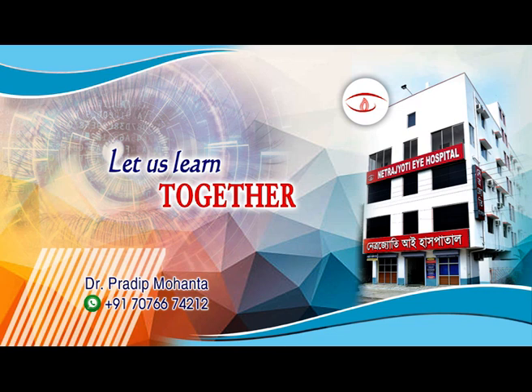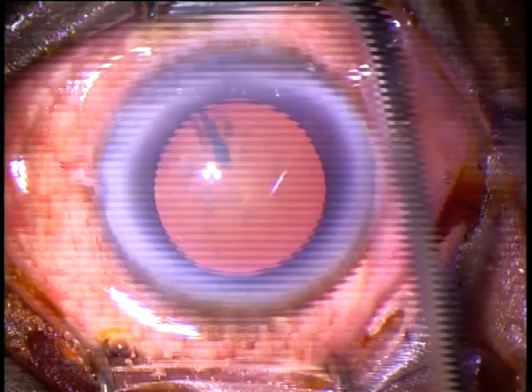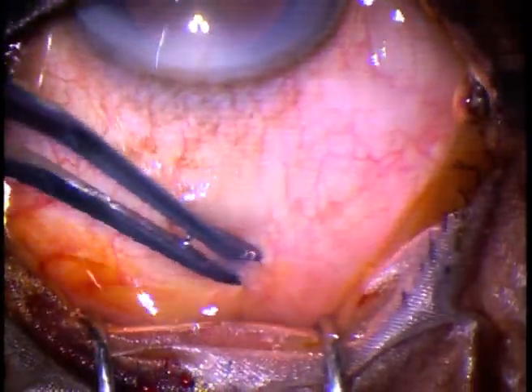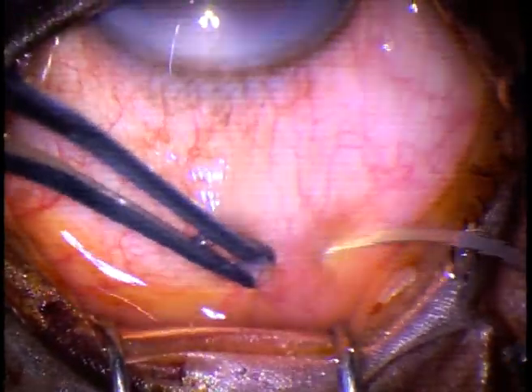Friends, welcome to my workplace at Ranagh Heart, West Bengal, India. This surgery is dedicated to ophthalmology residents all over the world. We are going to learn SICS, Small Incision Cataract Surgery, through this video.